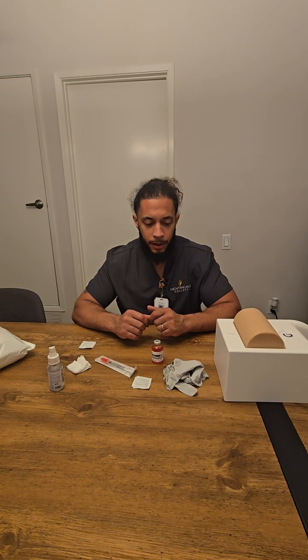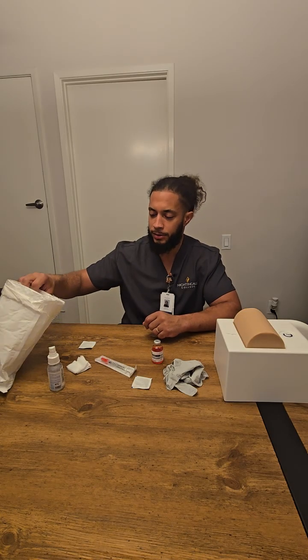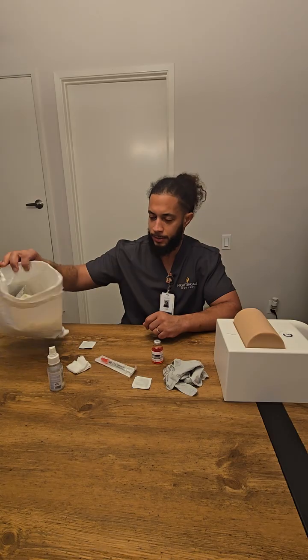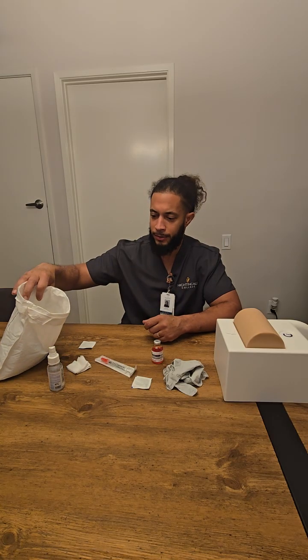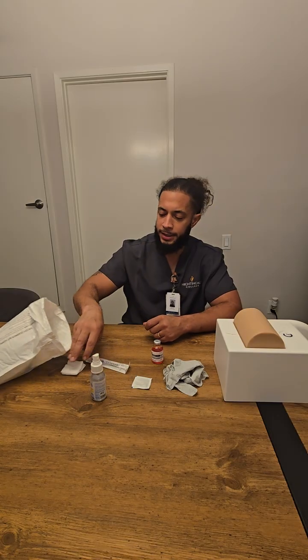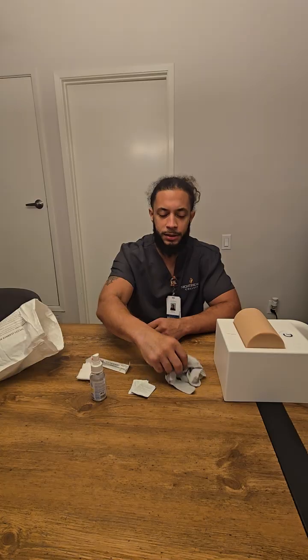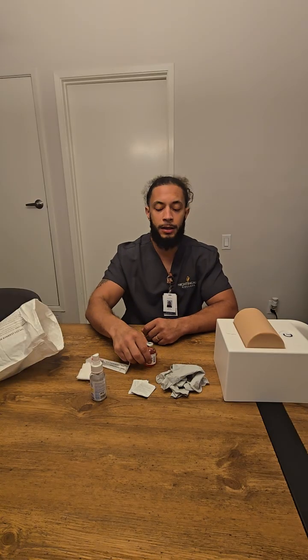All right, my name is Edwin, and I'm doing the subcutaneous injection demonstration. First, let's get our supplies. I have a plastic needle container, hand sanitizer, gauze, alcohol swabs, and gloves.